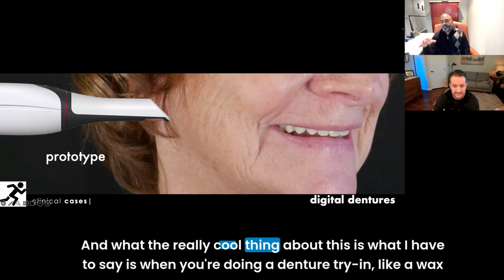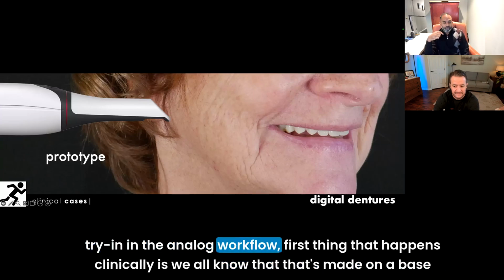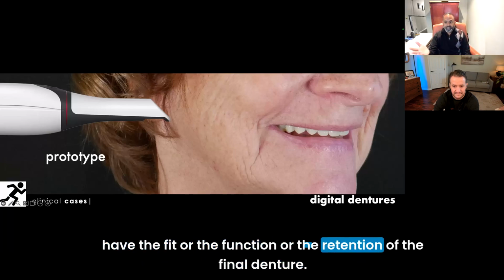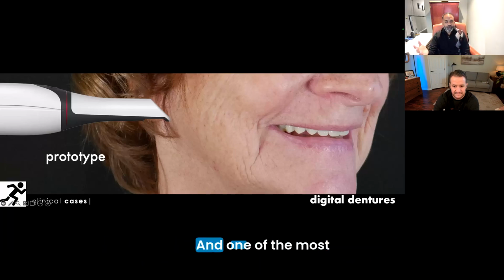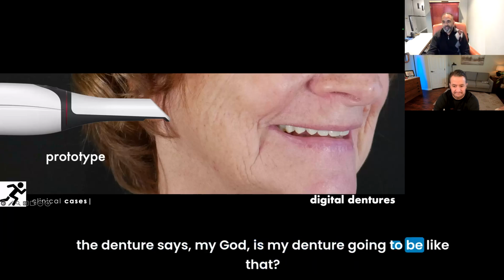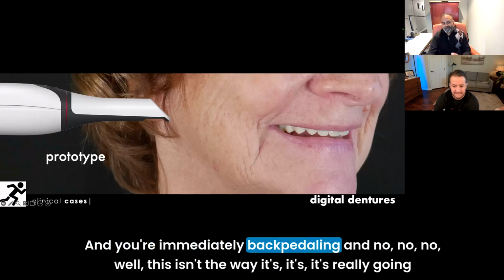And the really cool thing about this is, when you're doing a denture try-in, like a wax try-in in the analog workflow, first thing that happens clinically is we all know that it's made on a base plate off of the master cast. You adapt the base plate over, and it's not going to have the fit or the function or the retention of the final denture. One of the most common things is when you get to the wax try-in phase, you put the wax try-in, it falls right out of the mouth, and the patient says, oh my God, is my denture going to be like that? And you're immediately backpedaling.